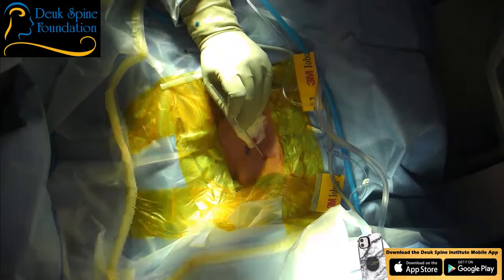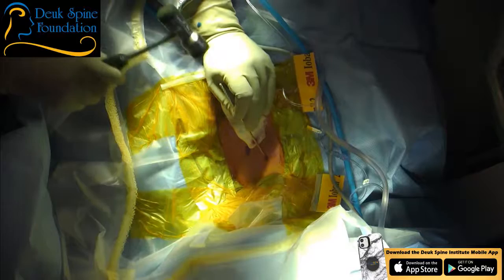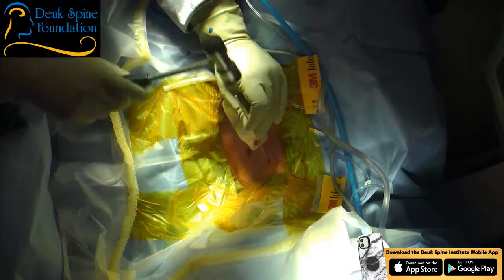If I can't get it manually, I'm going to bring my mallet. The mallet is a hammer. This is what upsets most people that watch this surgery — they see me hammering on the spine. But the truth is the hammer allows the surgeon to deliver a very specific force, a very short, very quick delivery of a force. Hammers are used all the time in spine surgery, so don't get upset when you see me use the hammer. It's safer than me pushing. So we want to head to the back of the disc, right where the herniation is.